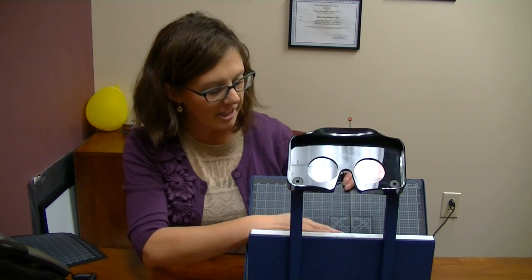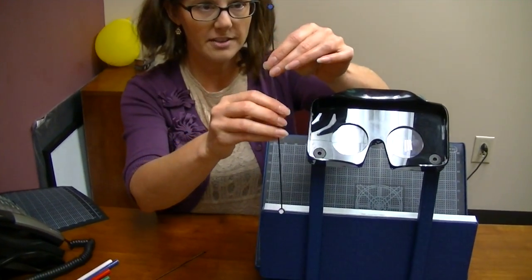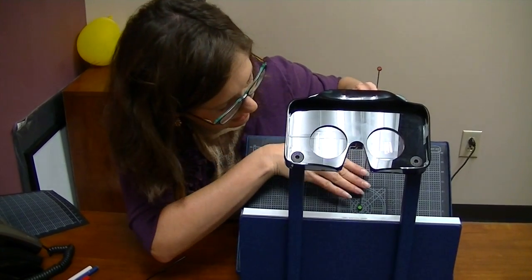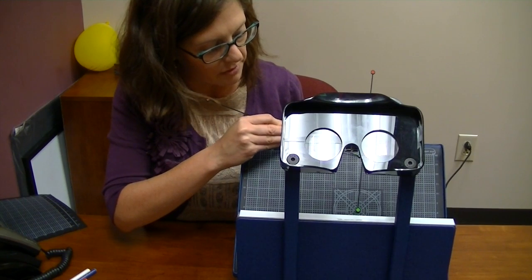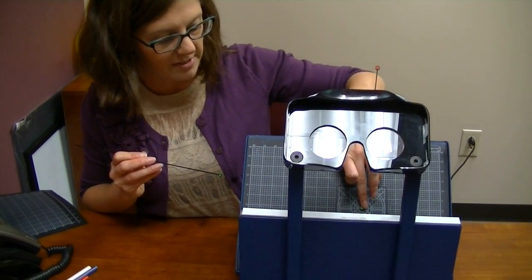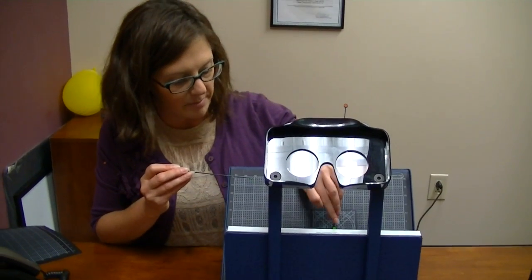On this particular test, we have the individual or patient sitting back behind here, so you're going to get the patient's view. They're going to be looking in the center at a target of a different color. Our wand has some different colors on it — we start off testing with green. As they're looking through the instrument, I also have a small wand, and I'll be bringing it in from the top, from the sides, from diagonals, asking the person as they stare at the centralized target: when can their brain first start to pick up this small color that looks exactly the same as the color they see in the center?